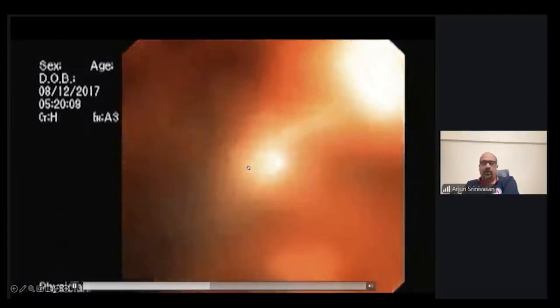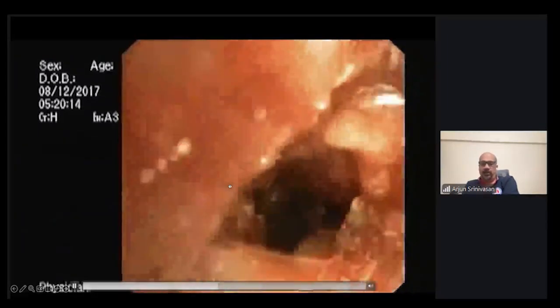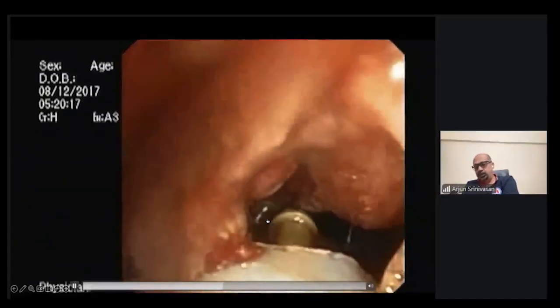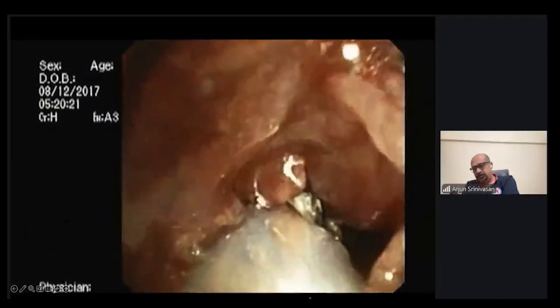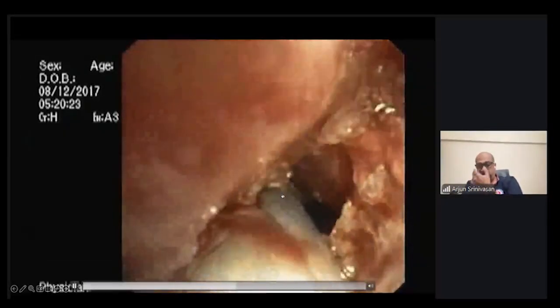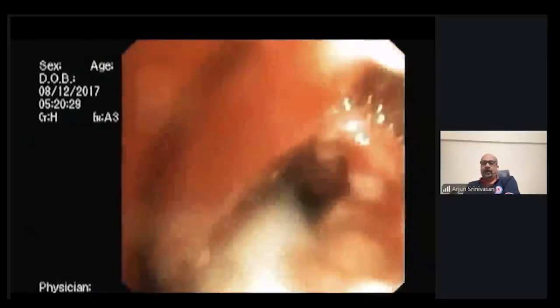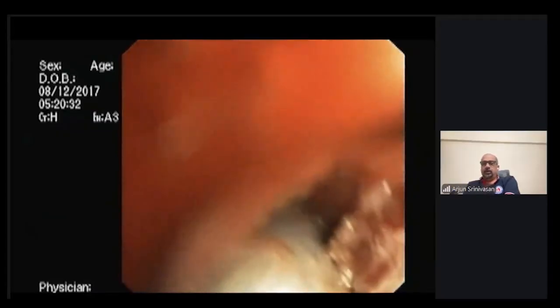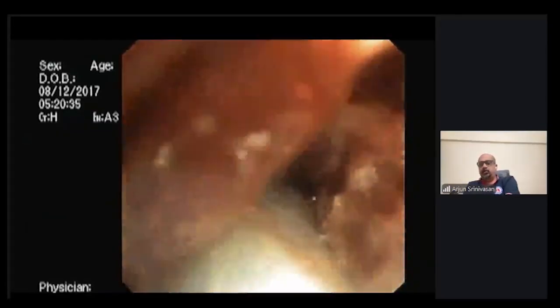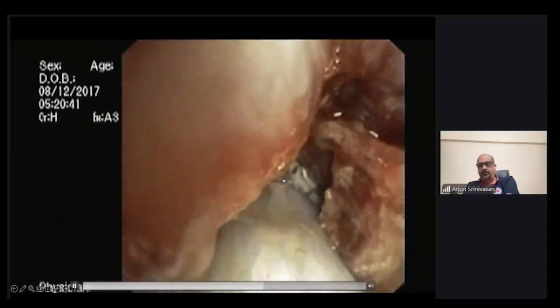But though there is a significant involvement of both the trachea as well as the left side, here you can see that the left side is being maneuvered into the left main along where the guide wire was placed. And here under vision, you can manipulate it, and you can see that the right limb has gone inside the right side. And once this is there and you are sure that you are on the carina, at this point of time, you can use a fluoro also to make sure that you are over the carina. And once this is done, the string is pulled, and again, fluoro can be used to confirm that the left and right has been deployed.